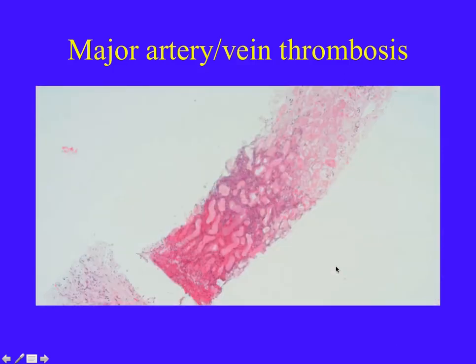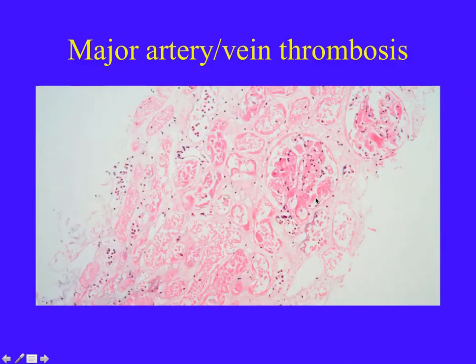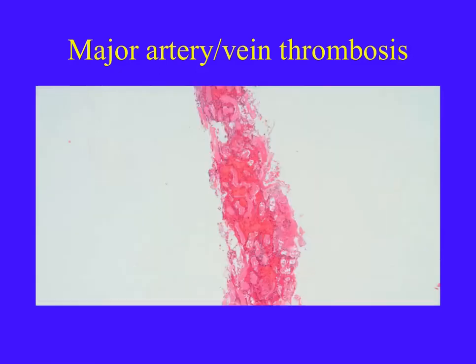The affected part of the kidney undergoes infarction with hemorrhagic appearances and ischemic type necrosis. The architecture here of the different components is retained, but no viable cells are present. So you can still see the ghosts of the tubular profiles and glomeruli, but no nuclei are present in the cells, and this is an indicator that this tissue is no longer viable. A similar case displaying widespread hemorrhagic appearances and also ischemic type necrosis of an infarcted kidney.